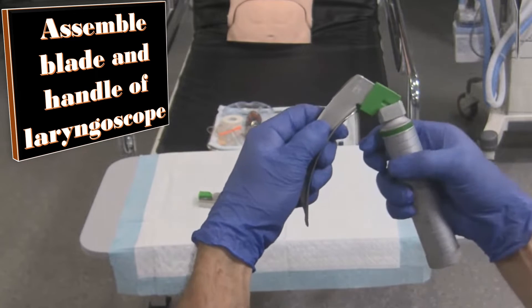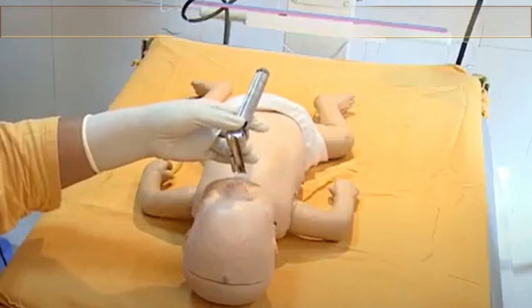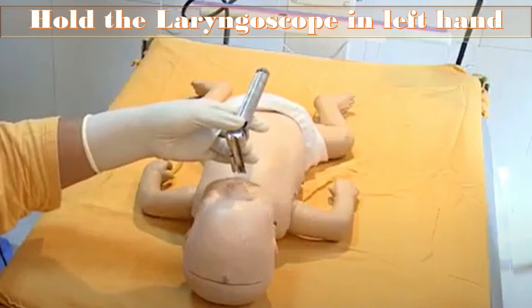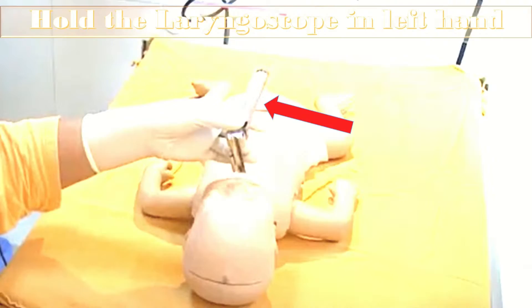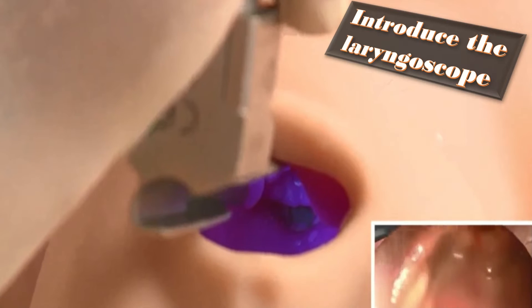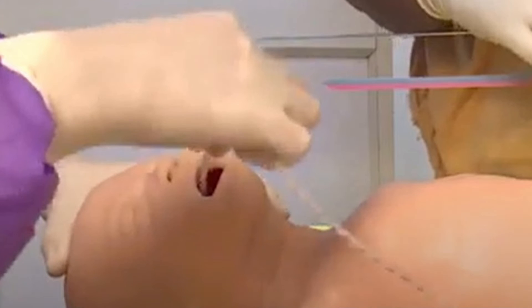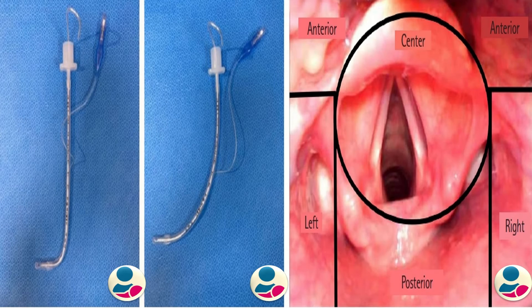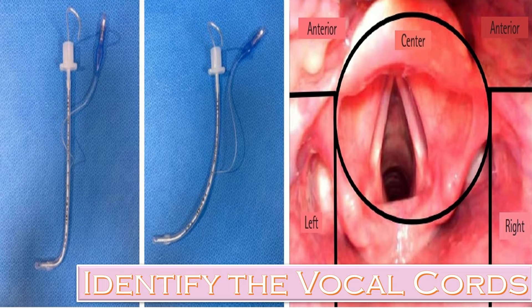Once the sterile trolley with all the equipment is ready, stand at the head end of the baby. Hold the laryngoscope in the left hand. Introduce the laryngoscope blade by pushing the tongue away and visualize the glottis opening. If there are lots of secretions, get the suction tip and clear the secretions as required.